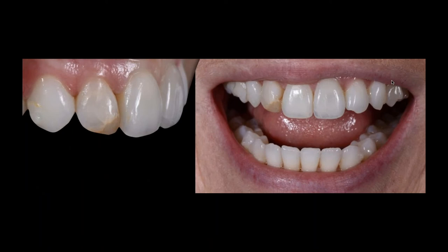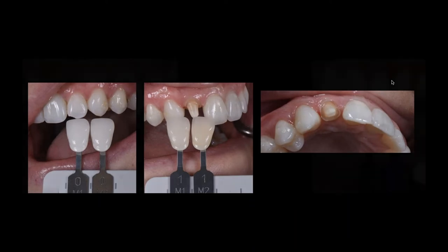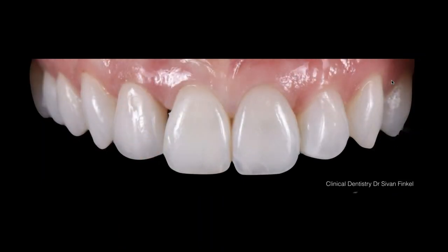And again, no matter what the restoration is, when there are smaller restorations, these are really challenging. So when you see a tooth like this, do I want a more opacified coping or do I want a more translucent coping? I definitely want something a little more opacified here so I can mask some of that underlying color and then create my ceramic layering on top of that. And that becomes more critical for me so I can really understand what I'm doing in my layering system to match the naturalness of the patient. And you can see that worked out fairly well for, again, a single unit.